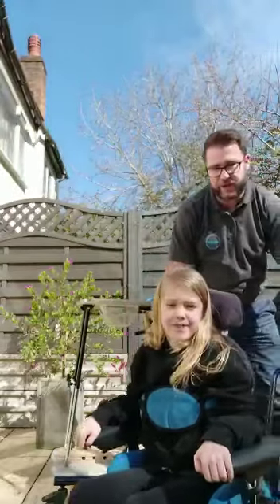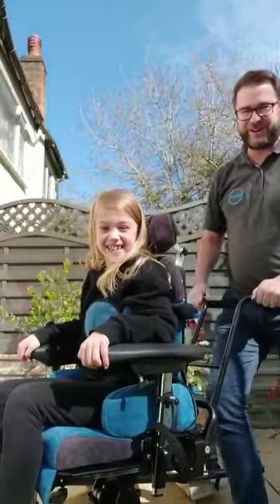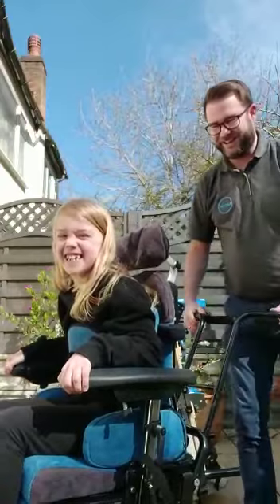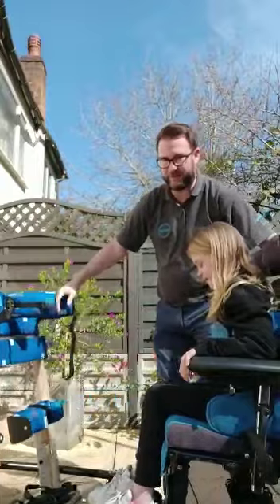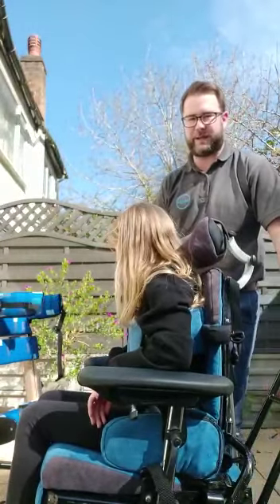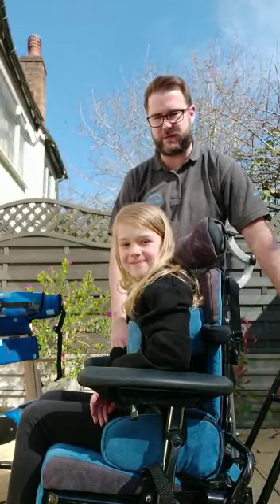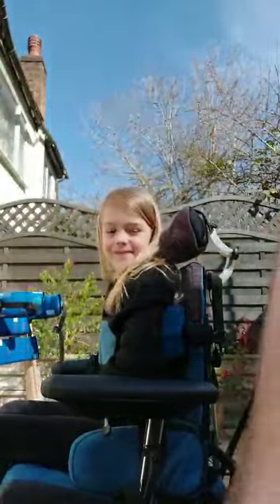As you know, our chairs have a high-low feature, so you can bring the child up or down. And there's our standing frame. What we're going to do with our high-low is take the chair down to the same level as the standing frame, so the feet can then go straight into the standing frame and Bella can help assist with the standing transfer. On all of our chairs, let me show you the high-low function.